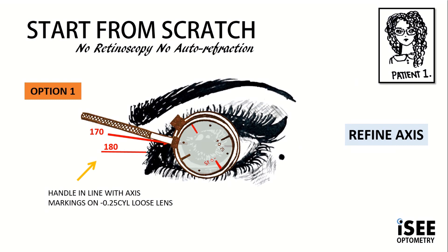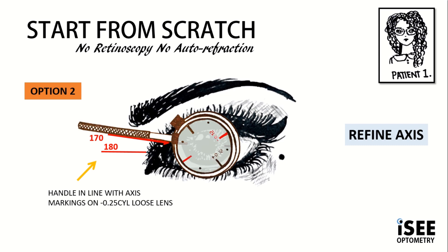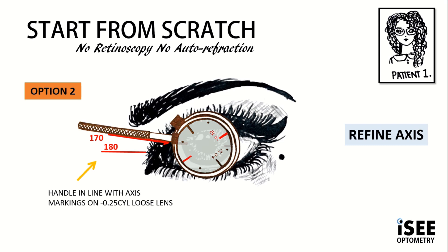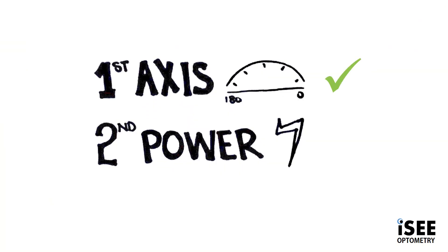We refine and repeat again. We align the handle at 170 and flip, showing the two options. With option one, we follow the red marking taking us away from the 180, closer to the 90. With option two, we're going closer to the 180. We show option one and option two, and Emily reports there is no difference — they're very similar. So we know that our axis is going to be at 170. Axis complete, now on to cylinder power.